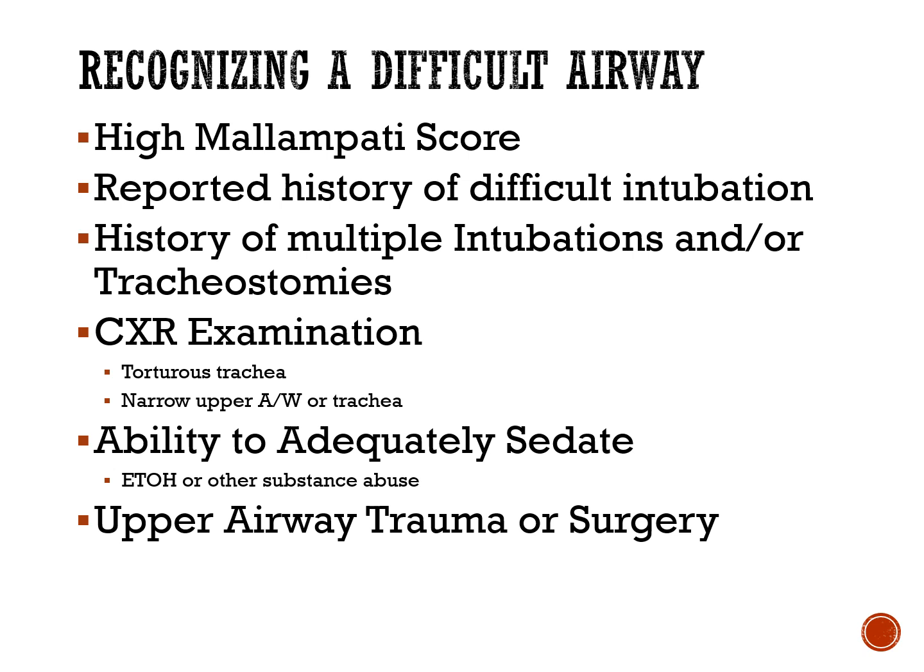Chest X-ray examination. If it's an elective intubation and you have the luxury and the patient's not crashing, but they're neuromuscular. It looks like their bedside mechanics have been going down precipitously. Check an X-ray. See if the chest X-ray goes up to the neck. Many times they do. So you have, is there a tortuous trachea? I will show you a couple of images. Is there a narrowing of the airway or trachea?